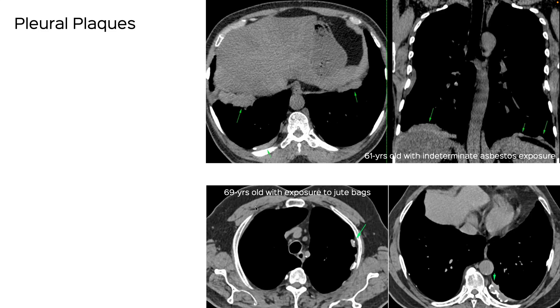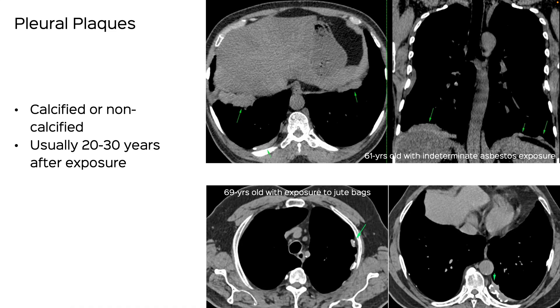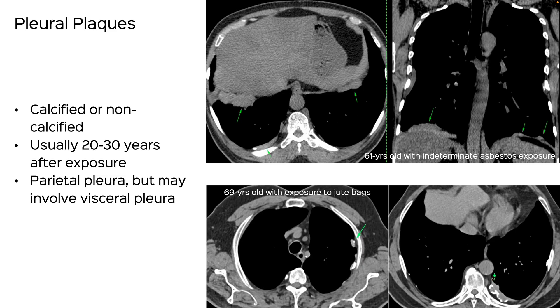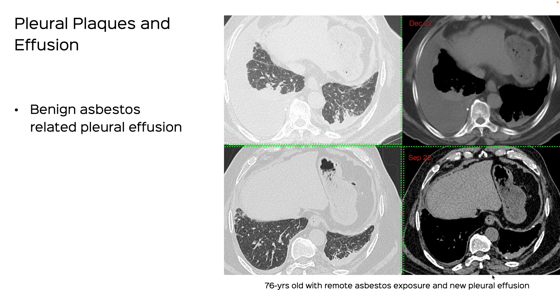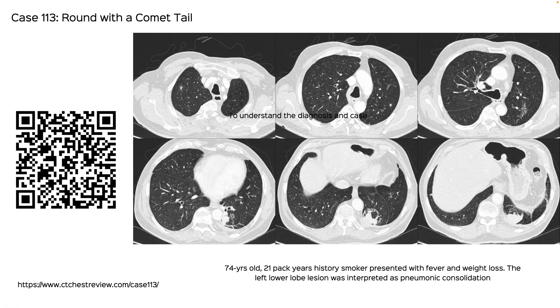I'll show the URL later where I discussed pleural plaques, shown here in two different patients. They can look a little different but can be calcified or non-calcified. They usually occur 20 to 30 years after exposure, typically involve the parietal pleura but may involve the visceral pleura. You can also get benign asbestos-related pleural effusion, and of course mesothelioma.